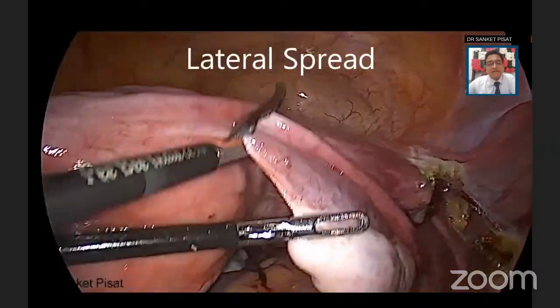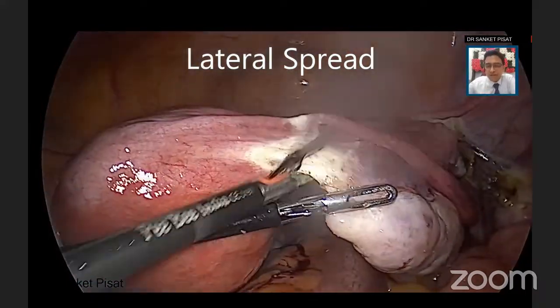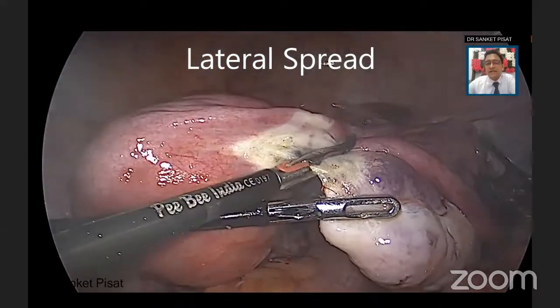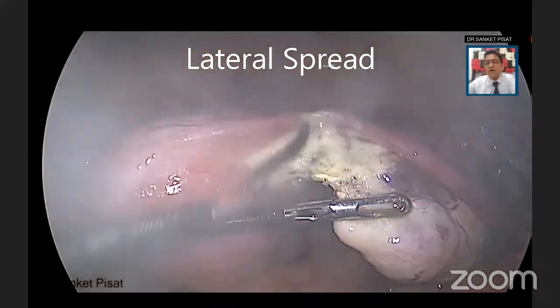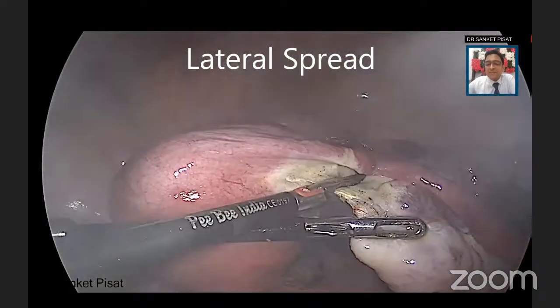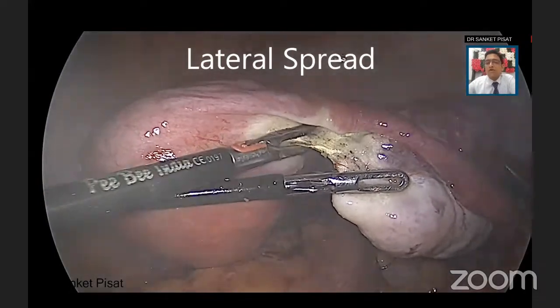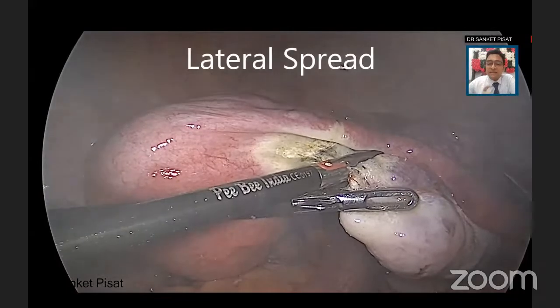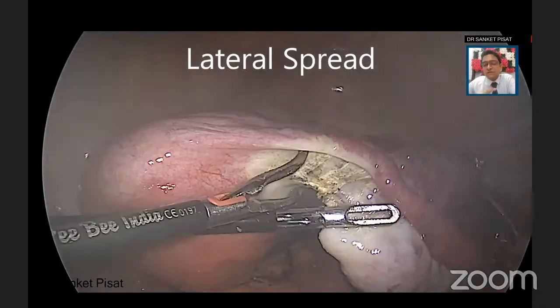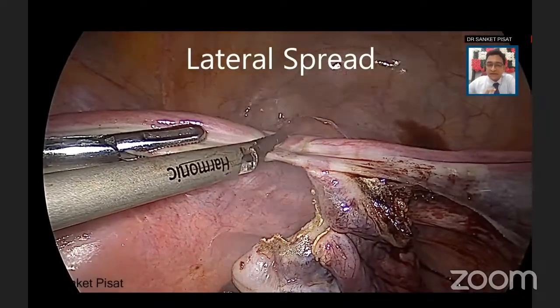So other than dissection, there is also the concept of lateral spread. Now here, this is not an ultrasonic, this is a bipolar, and you can note two things. See the amount of lateral spread that is happening here. This is up to a centimeter or sometimes 2 centimeters depending upon the time of application and the nature of the tissue. But needless to say, there is a lot of lateral spread of current, and the surgeon must be aware of the lateral spread that is happening if this sort of instrument is being used. So it is giving very good coagulation, but there is lateral spread.